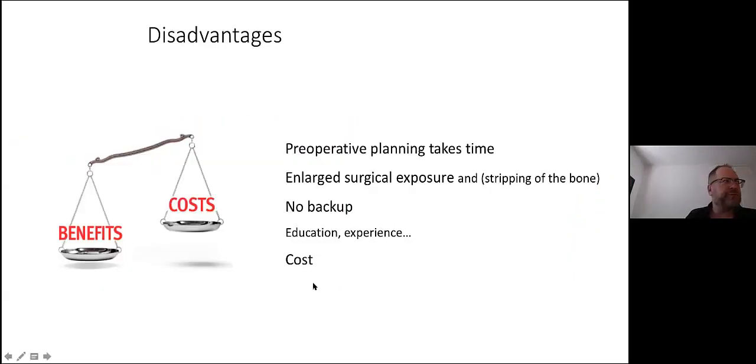Now, today I've only spoken about malunited fractures, and then you have a couple of months to plan and prepare. But if you're going to do fractures, which I think will be a big part of this, where you will use it a lot in the future, then it's difficult to send to plan with a company in Europe, even if you do it over Zoom, because they have to send the guides and check it.